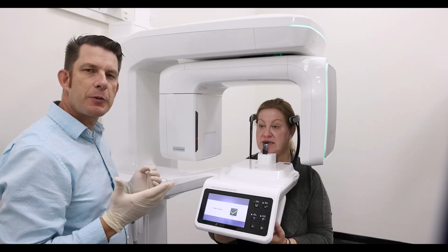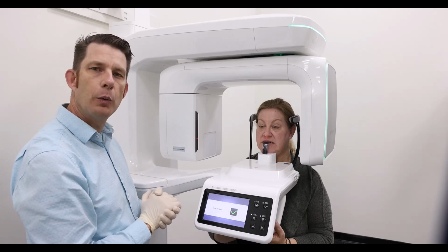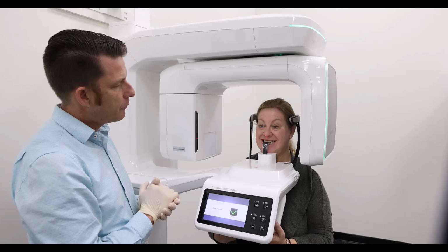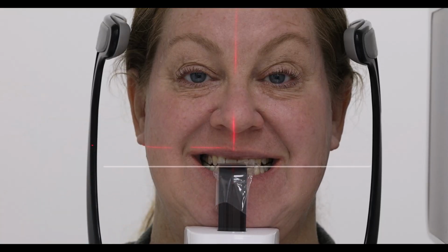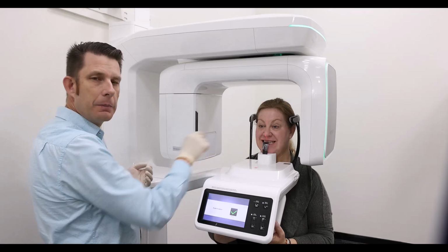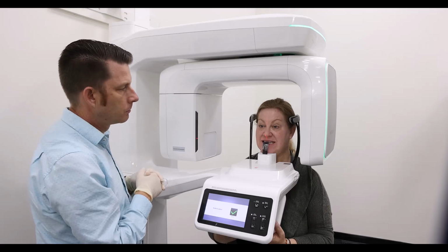For CBCT capture, it's important to ensure that the patient's occlusion is flat or parallel with the floor. So go ahead and smile for me. And I'm evaluating the maxillary occlusion to ensure that it is a flat plane of view. I do see this red horizontal beam shining on the right side of the patient. I use that as a reference to ensure that the patient's occlusion is flat or parallel with that line.